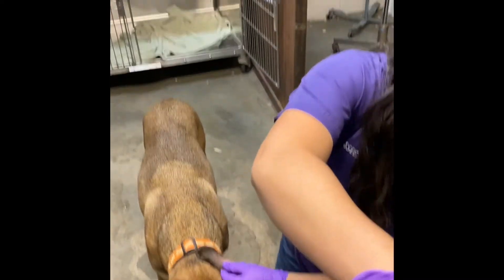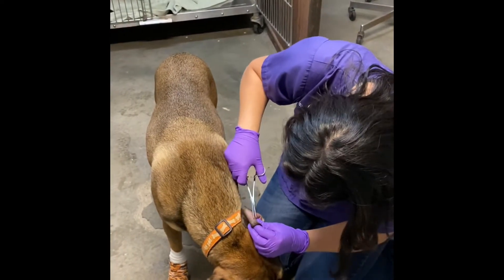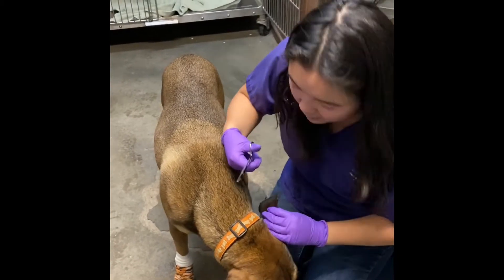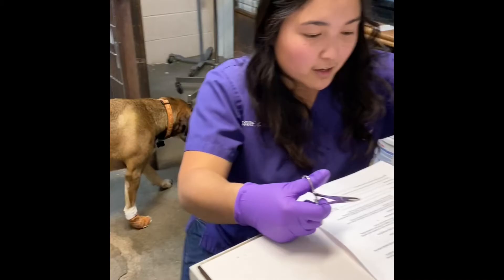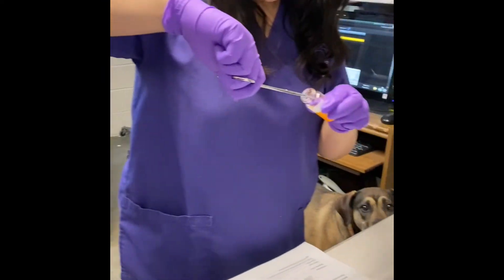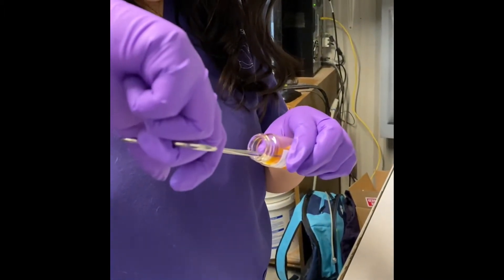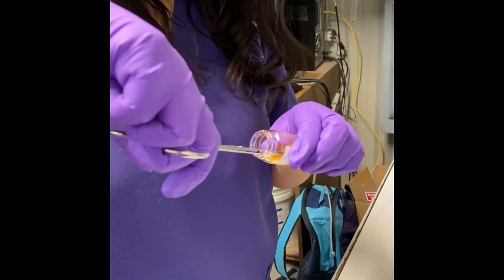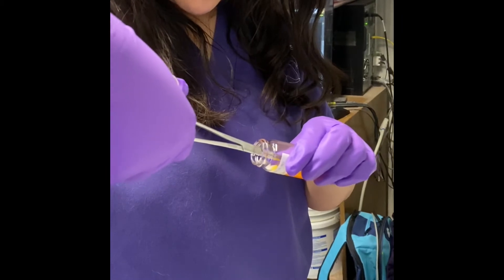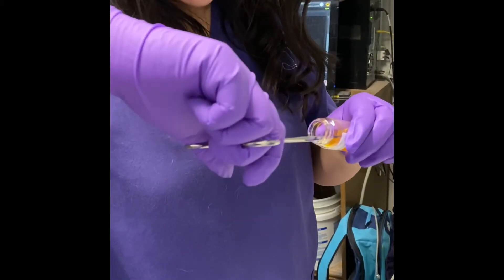I'm going to go ahead and use some hemostats to pluck some hair in the area. Now that I got some hair, I have my DTM tube right here, so I'm going to go ahead and just get it on there, set it down, and get it right below the — what is it called — the gel that's in there? The media? I couldn't think of the word.